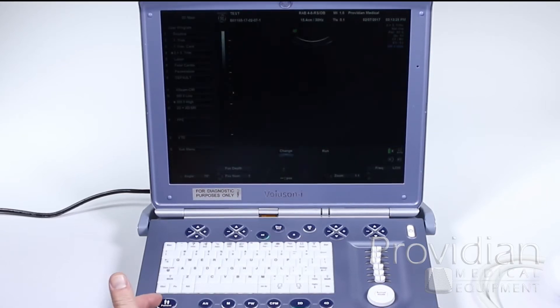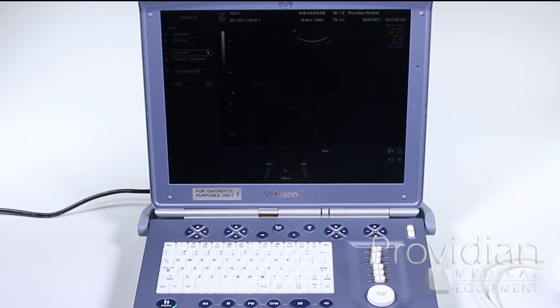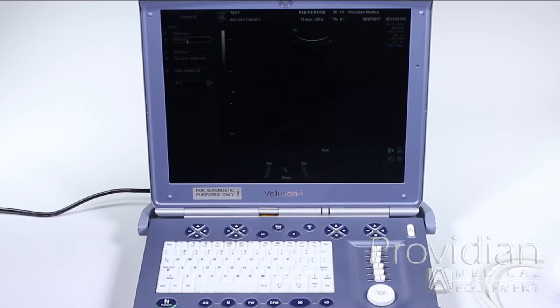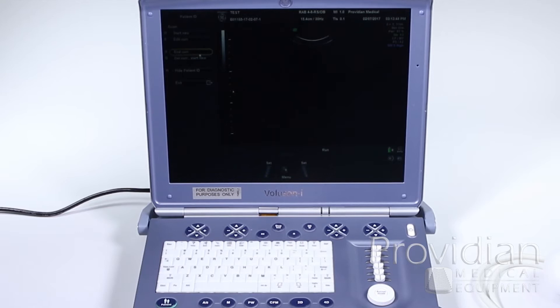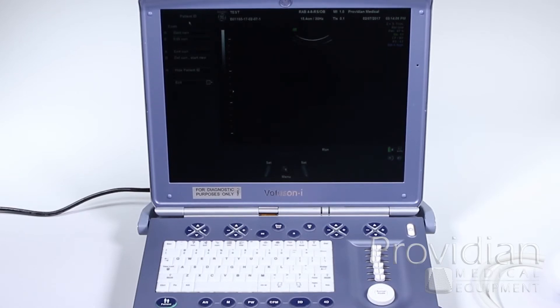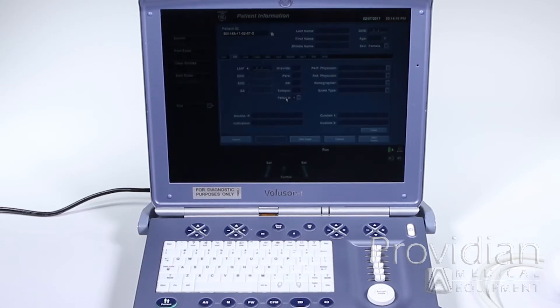Now if I did want to go to a previous patient, I will hit that patient key. Notice I hit that patient key and nothing happened — you're waiting for the patient screen to come up. Whenever that happens and nothing appears, look over here because it is waiting for you to do something. It's saying do you want a new patient, do you want to edit the current patient, and so on. Right now we want to click start new or end current. Go ahead and delete the current patient and start a new patient.